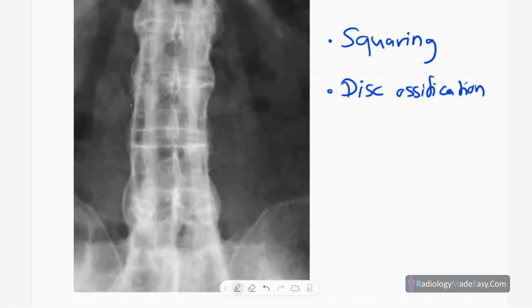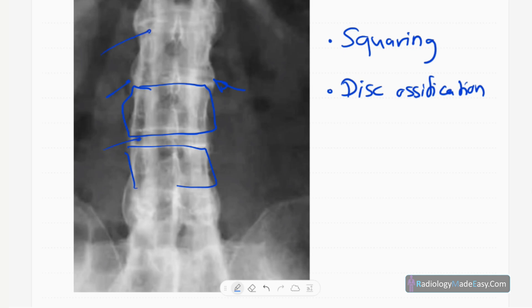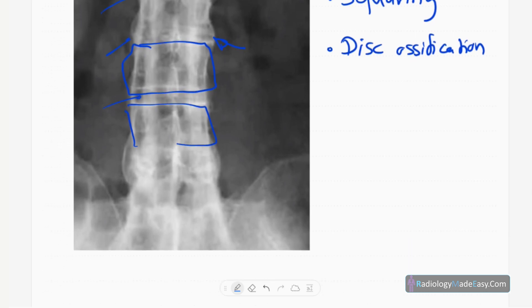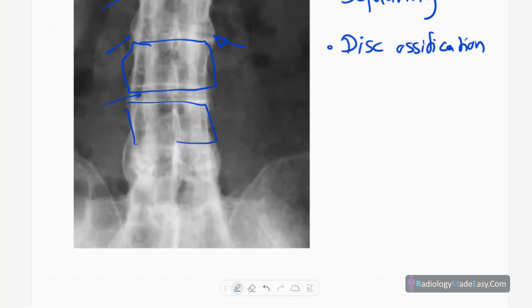In another patient, you can see fusion of the vertebral bodies and also squaring of the vertebral bodies. There is subtle disc ossification and squaring of the vertebral bodies, along with ossification of the annulus fibrosus.